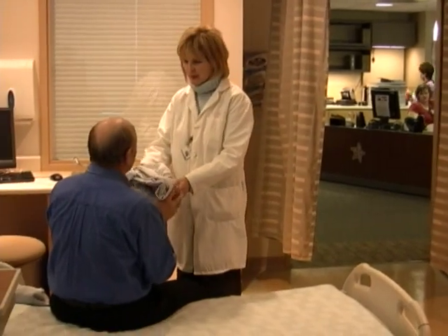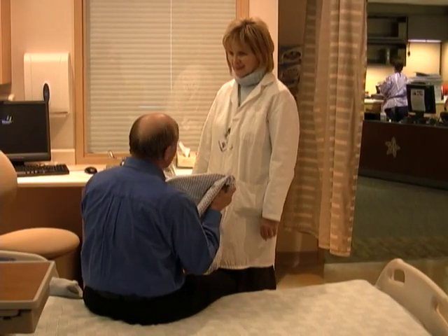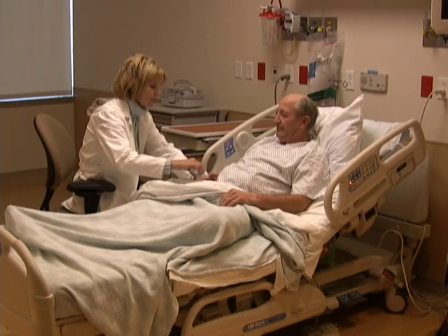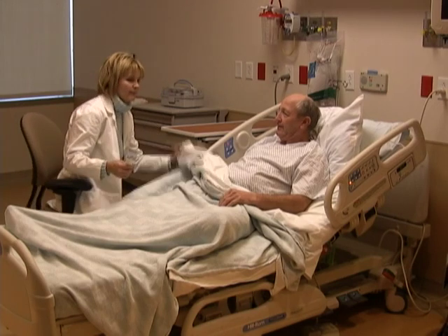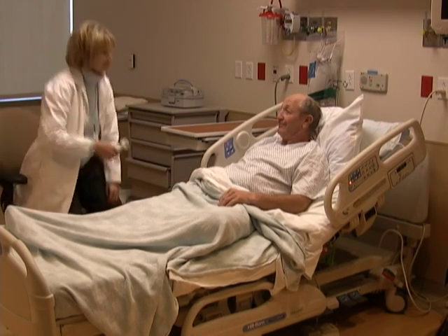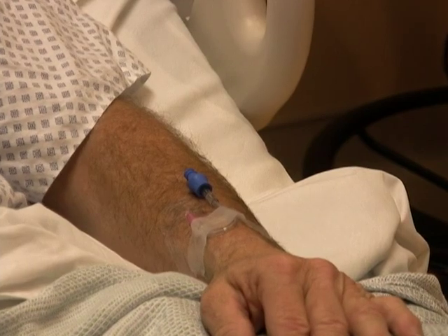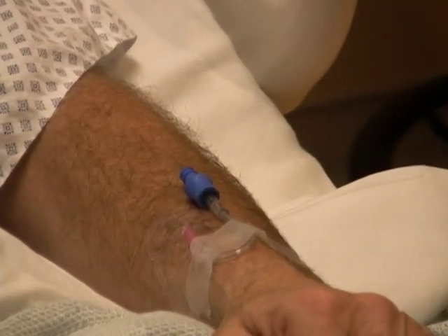When you arrive at the hospital or clinic, you'll fill out paperwork and change into a gown. A nurse will clip the hair from the patch of skin where the catheter will be inserted. This is often in your groin, but maybe in your arm or wrist. You'll get an IV line in your hand or arm, and we might draw some blood for lab tests.